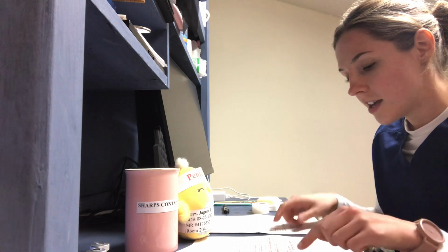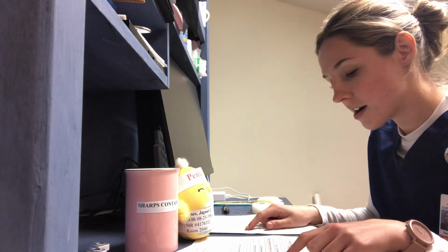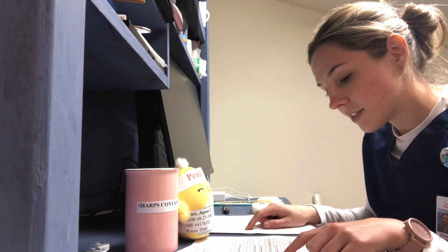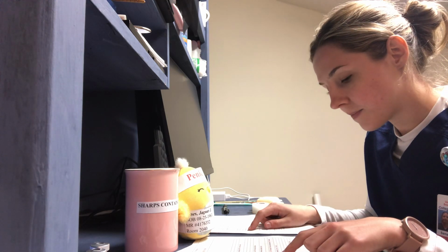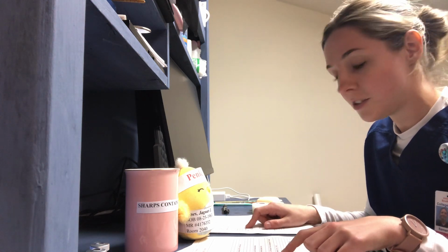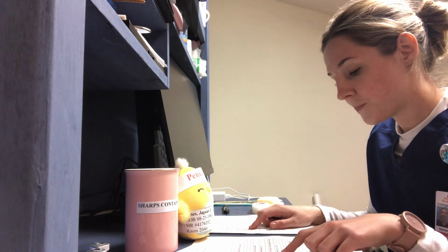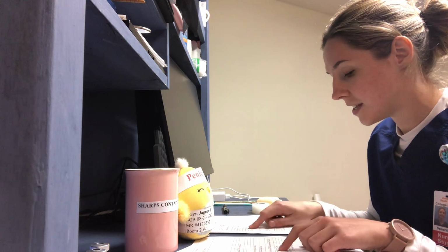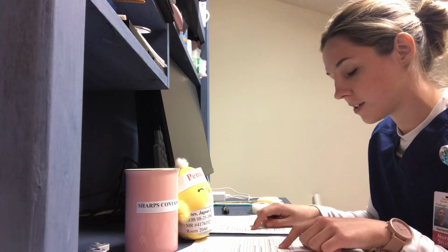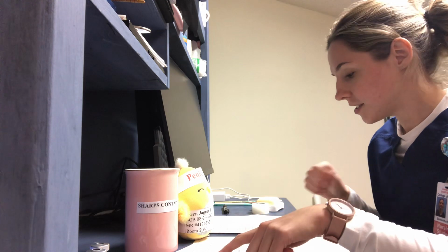Now I'm going to check the right medication, heparin in the chart, heparin in the MAR, the right dose, 5,000 units subcutaneously, 5,000 units and 5,000 units in the MAR. Then subcutaneously is the route, and subcutaneously is in the MAR as well. They match. The time is every 12 hours. The time is every 12 hours. Those match as well.